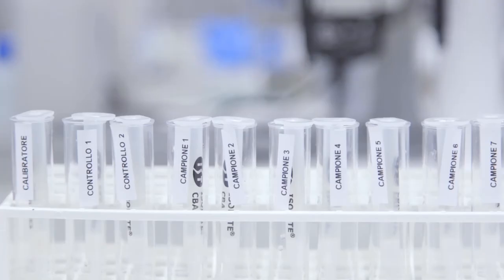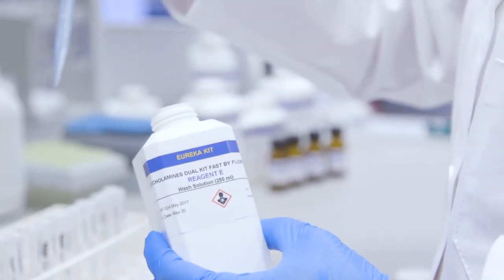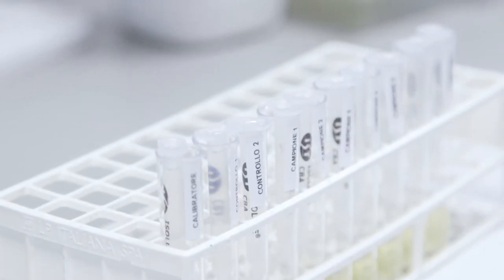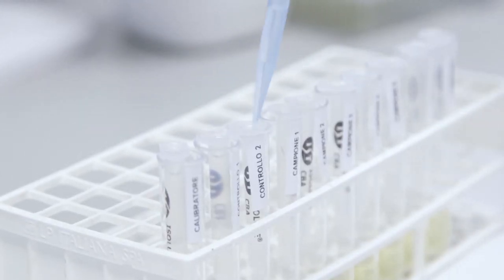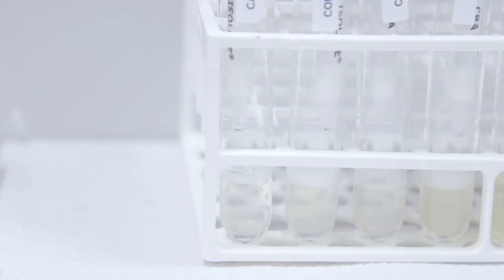At this point we wash the SPE column adding one milliliter of reagent E washing solution and repeat this operation twice. We conclude this operation by drying the resin with a light flow of air. These two washes allow us to eliminate all interfering substances.